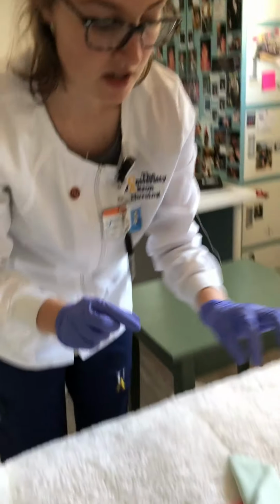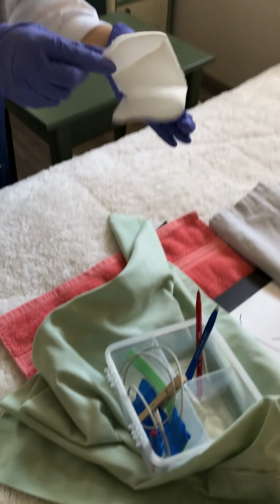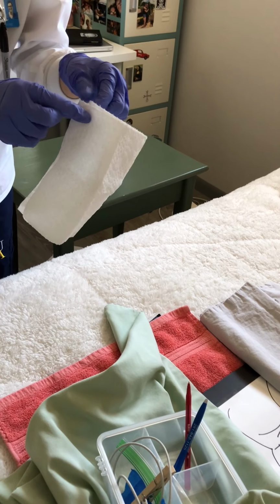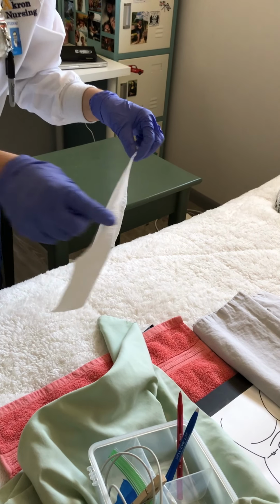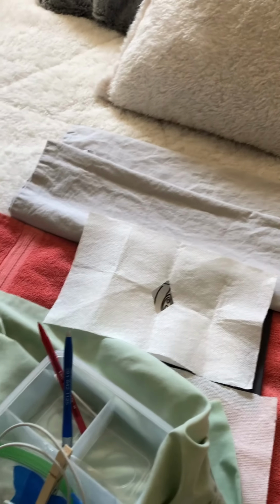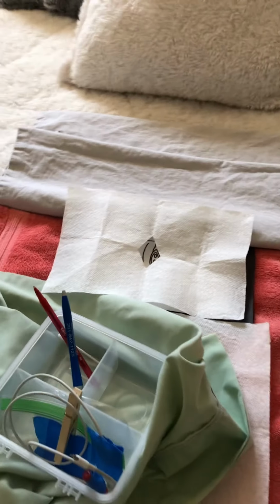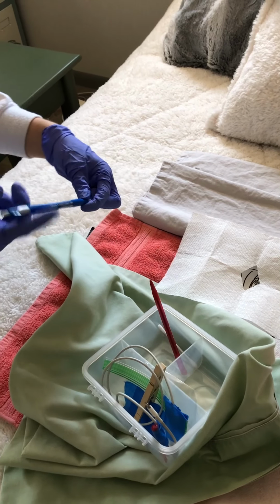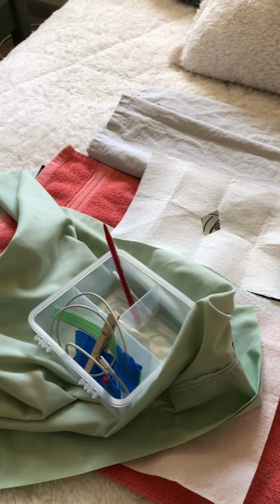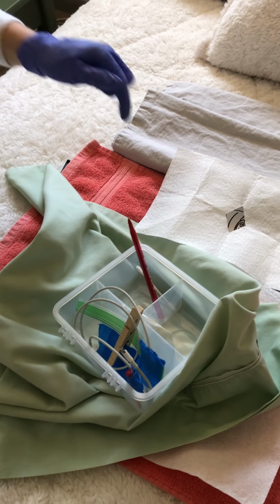So what I'm going to do first is place the fenestrated cloth over the patient's perineum to just expose part of the labia and the urethral orifice, just like that. And then I'm going to take the lubricant and place it in the receptacle and then go ahead and discard of that.